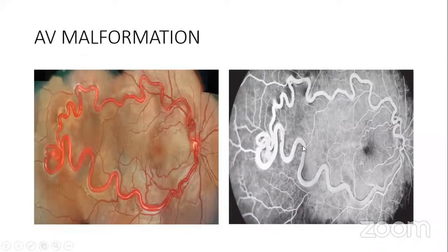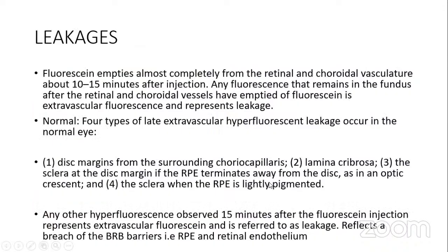and when you do your FFA, you see it's delineated. So this gives you an abnormal hyperfluorescence as well. So, okay.